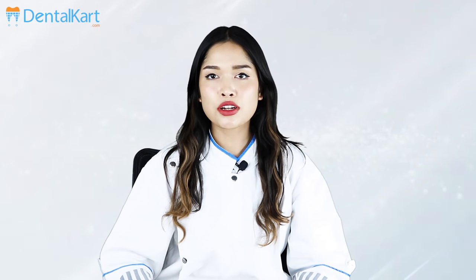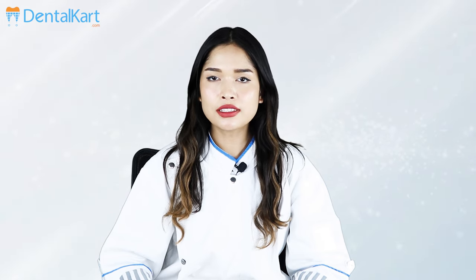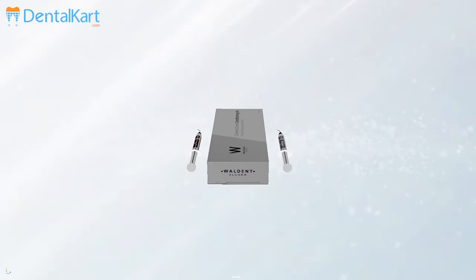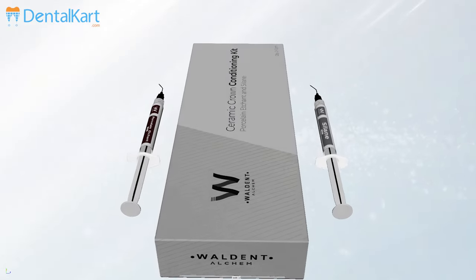Hello everyone, today our product of choice is Waldent Ceramic Crown Conditioning Kit. The kit comes with a porcelain etchant, which is a 9% buffered hydrofluoric acid used to etch porcelain veneers, crowns, bridges, inlays, and fractured dental porcelain.